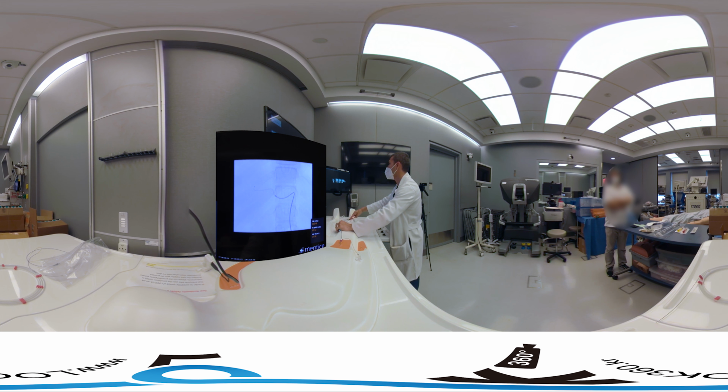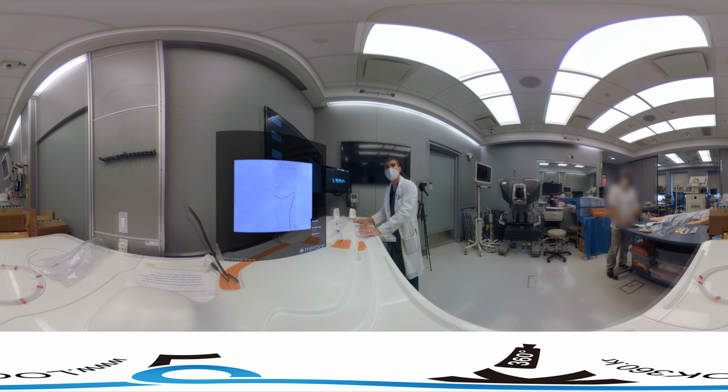We're going to do a little injection here, see what it looks like. So you can see there that directly supplies the tumor. So we're in a really good position now to start our embolization. So we're going to lock down our microcatheter here, and we're going to go to the next step.